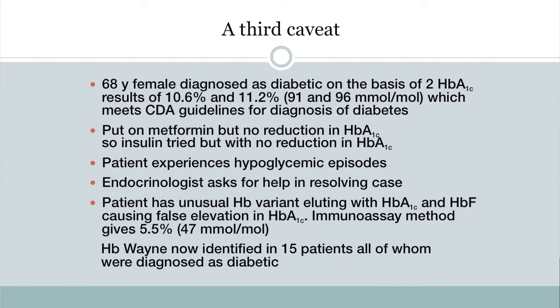So we've seen one too low and one too high. Here's a third caveat: a 68-year-old female diagnosed as diabetic on the basis of two successive elevated hemoglobin A1c results, meeting the Canadian Diabetes Association guidelines. She was put on metformin with no reduction in A1c. The physician then initiated insulin therapy, and the patient experienced severe hypoglycemic episodes. The endocrinologist asked for help in resolving the case.